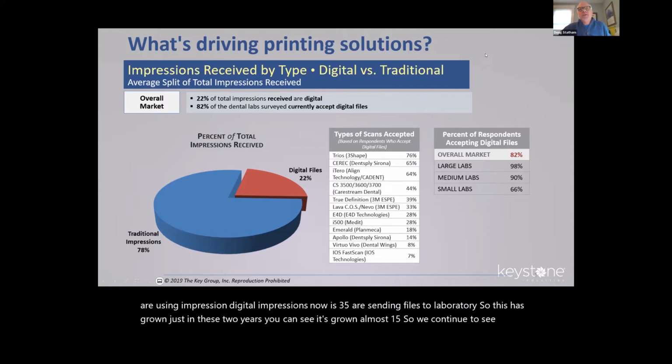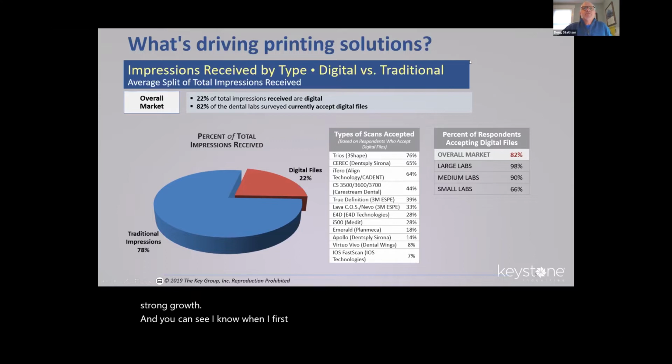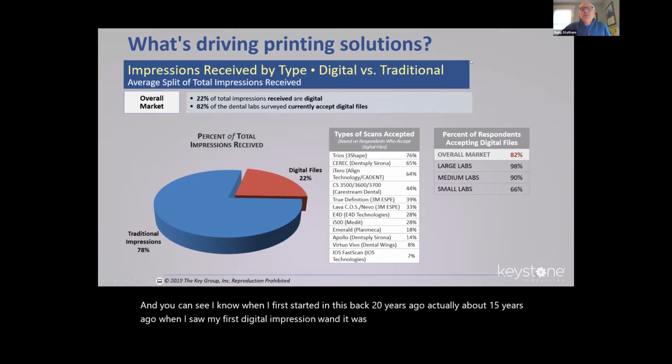I know when I first started in this about 15 years ago, when I saw my first digital impression wand, it was the Cadent technology, and that was really the only one that was out there.